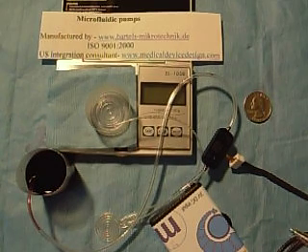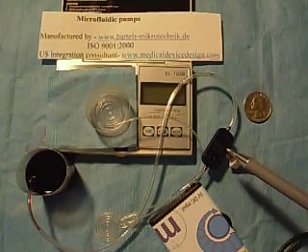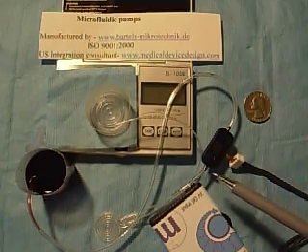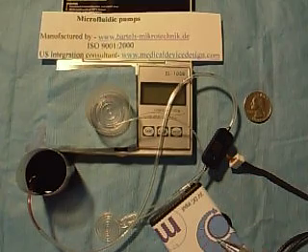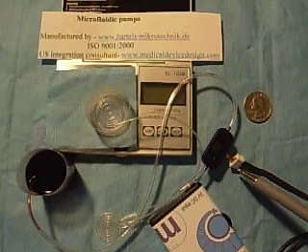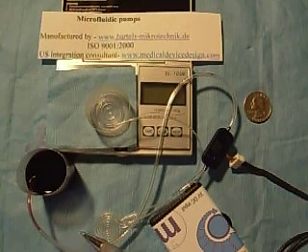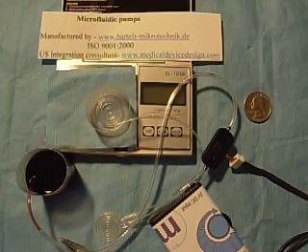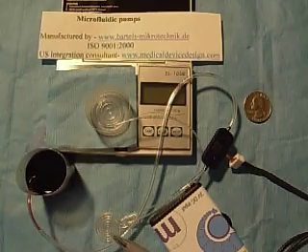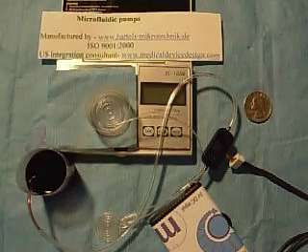The setup today is the pump connected to a controller board inside this case here with several double-A batteries. The connector is a four-conductor Molex. Tubing is connecting a liquid source through a fluidic device, which we manufacture in all shapes and sizes, and then on to the electronic balance collector.